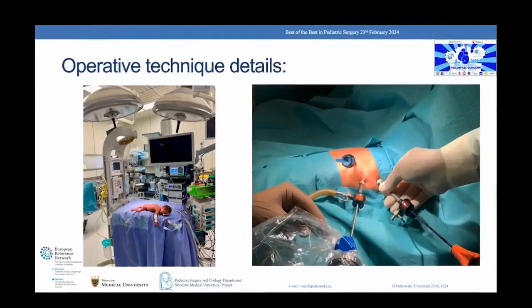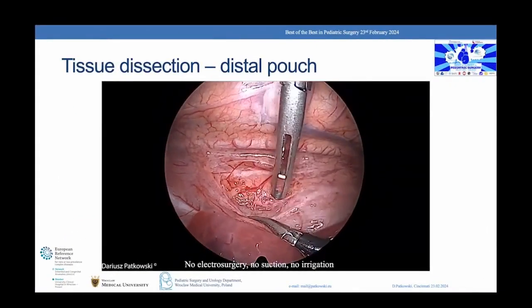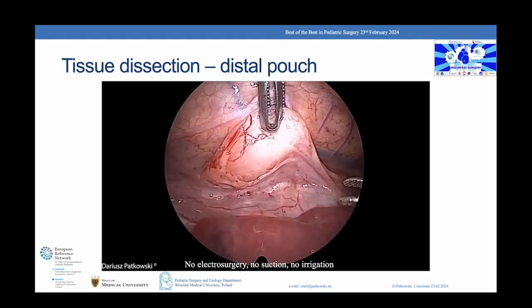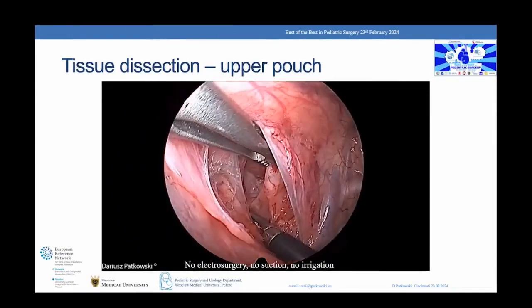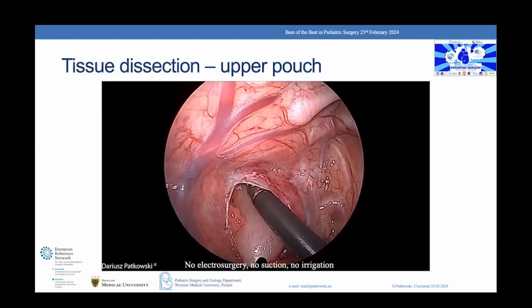The patient lies in prone position on the edge of the operating table. The right scapula is the anatomical reference point for trocar placement. The distal esophagus is usually located at the level of the diaphragm; it is dissected bluntly from surrounding tissues. The upper esophageal pouch and, if present, the fistula are dissected in a similar manner. There is no need to use electrosurgery.